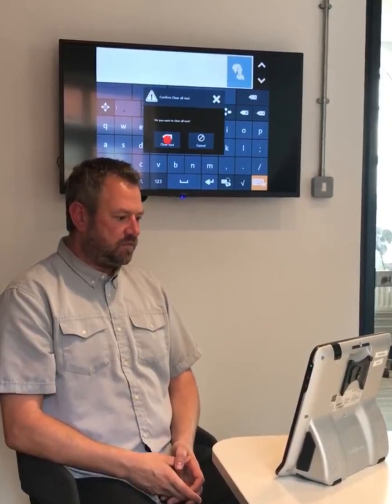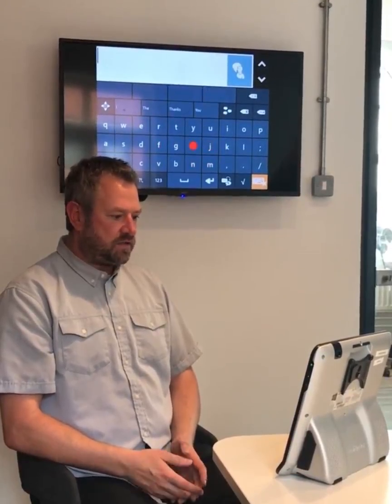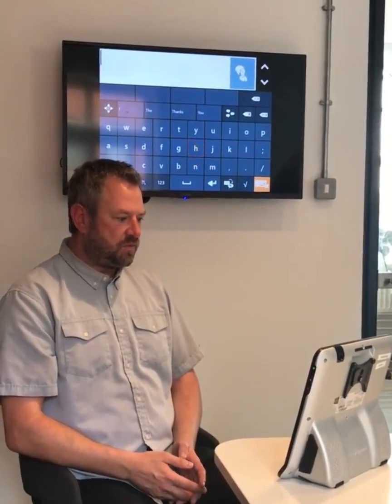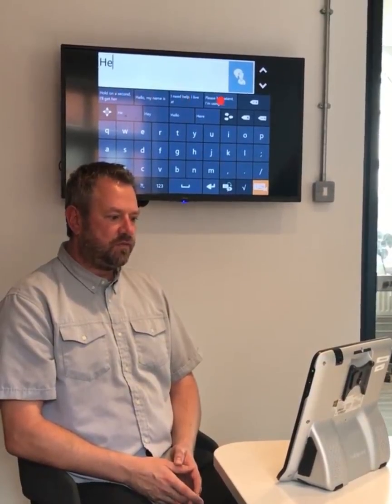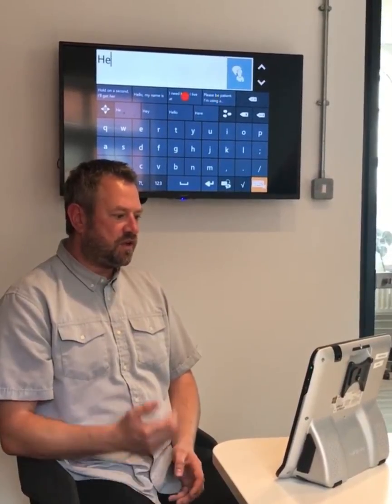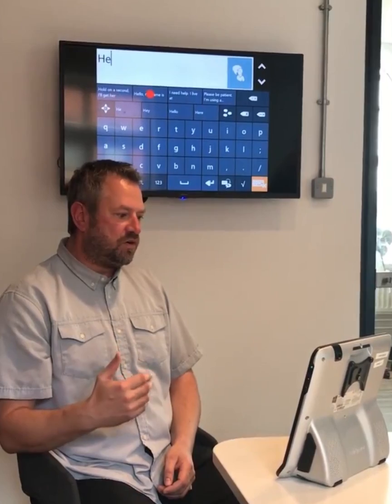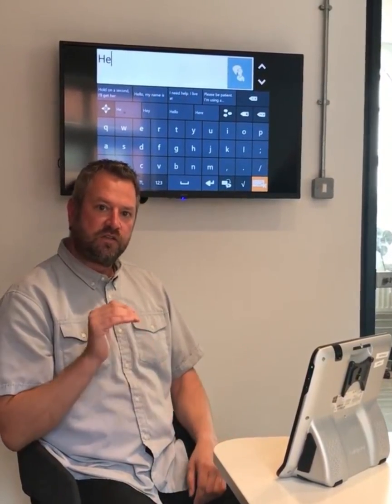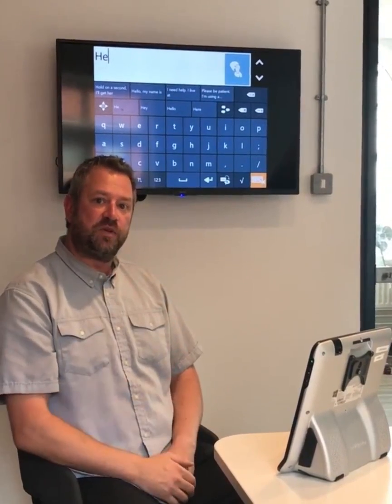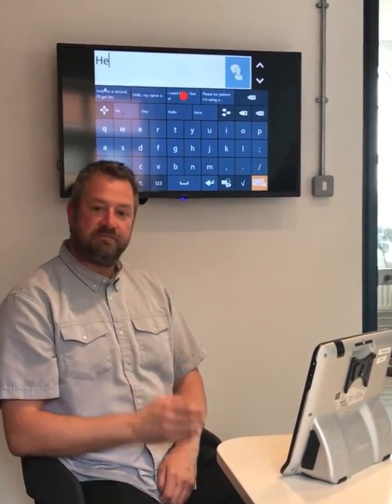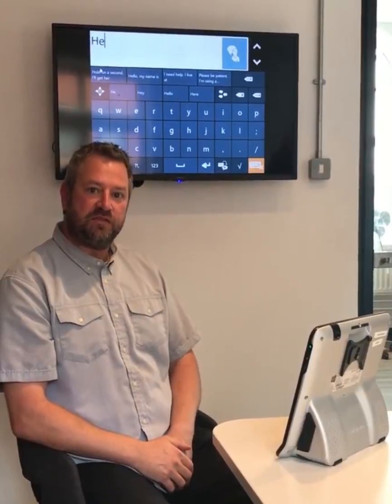So now when I come out, I can just get rid of that W again and we'll start again. I can still type super fast when I'm saying 'hello.' But then, when I get onto my phrases up at the top, you can see the dwell time automatically, all by itself, slows right the way down and lets me choose the right phrase. So my phrases are back being super useful again. And that's it — dwell times in Communicator 5.